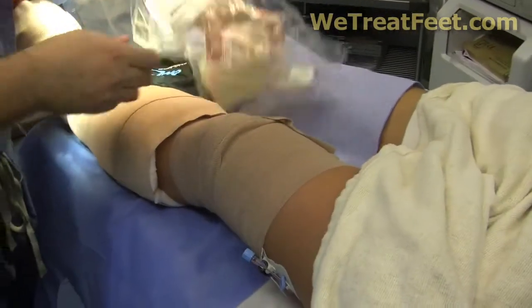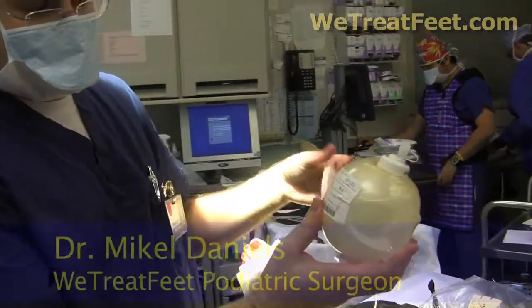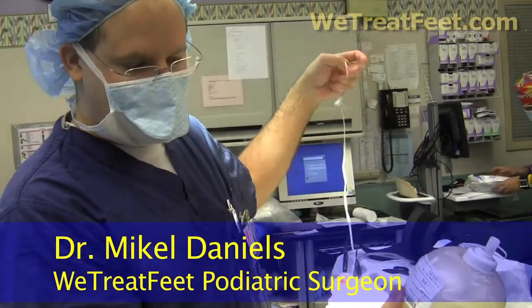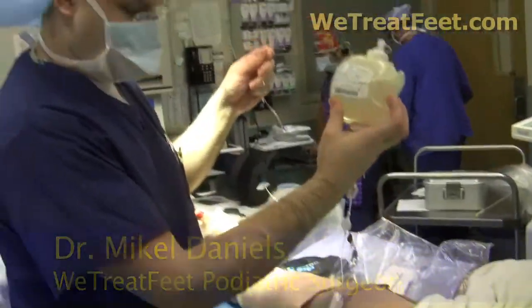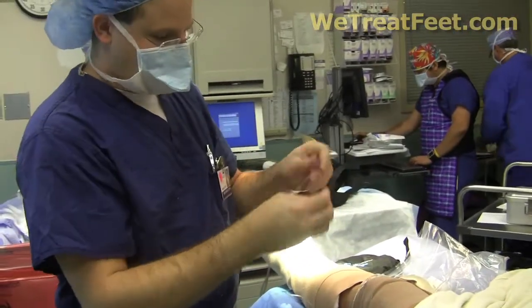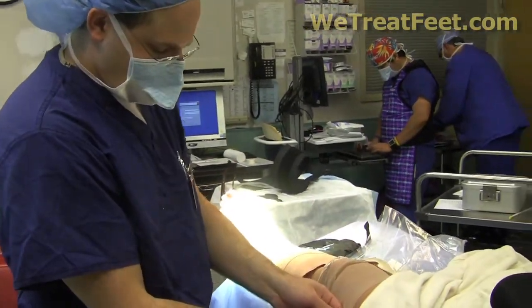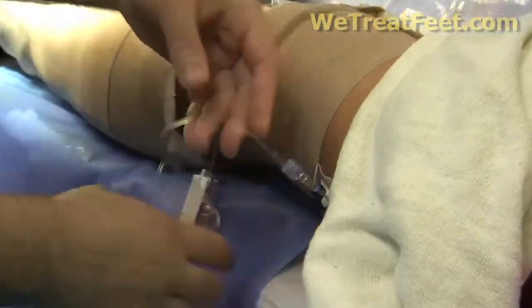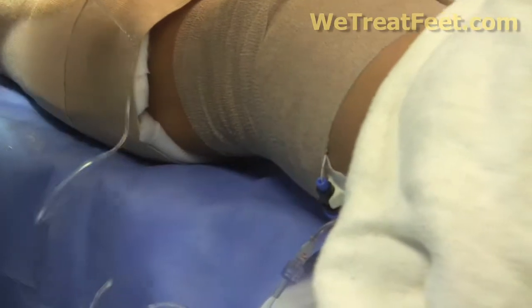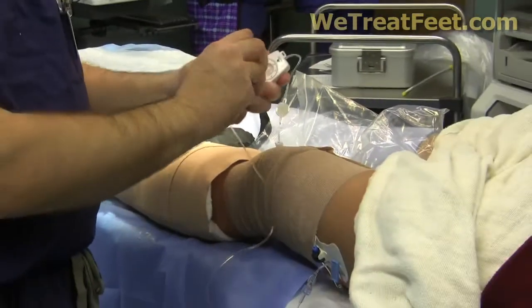So this is the OnQ pump, and it's filled with 750 milliliters of 0.25% bupivacaine. And it comes in the ball, and we remove the catheter and attach it where anesthesia had originally put it. We make sure the clips are off, and then we set the pain pump. And we can control the flow rate, and for her, we'll allow it to flow at 4 mLs per hour.